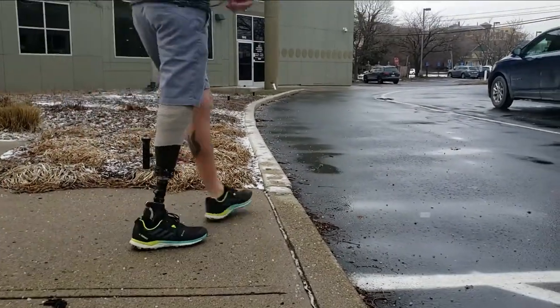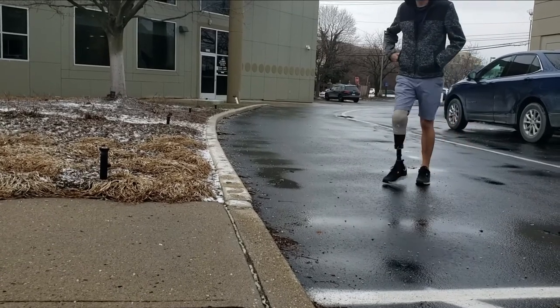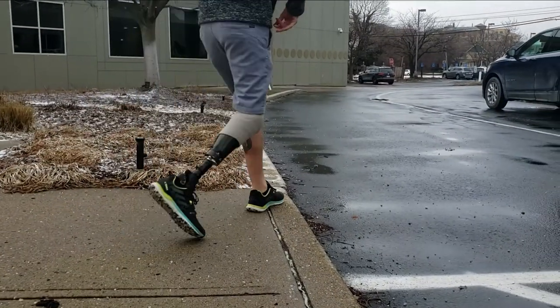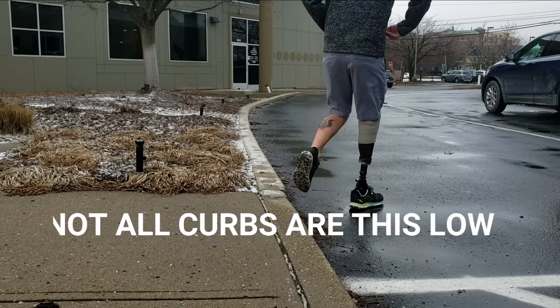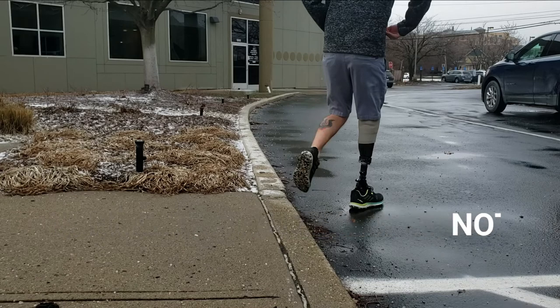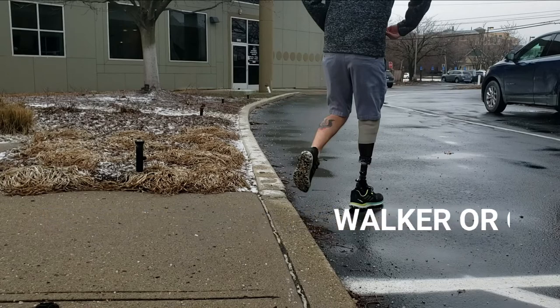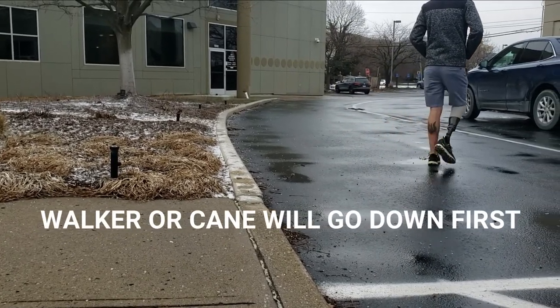Going up and down curbs is just like going up and down stairs. You'll typically step down with your prosthesis first. In this video, Mark goes up with his prosthesis first as well, though you might not feel comfortable doing that. Note that the curb filmed here is relatively low. If you're still using a walker or cane, the walker or cane goes up first, then you step up; the reverse is true going down — walker or cane goes down first, then you step down off the curb.